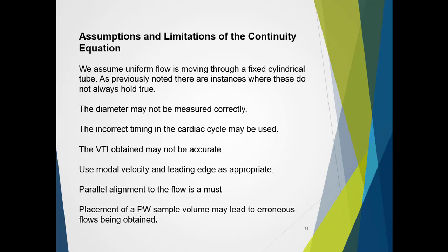The VTI attained may not be accurate. The modal velocity and leading edge need to be applied and traced appropriately. And parallel alignment to the flow is required. The ultrasound being off angle will reduce the end result obtained.